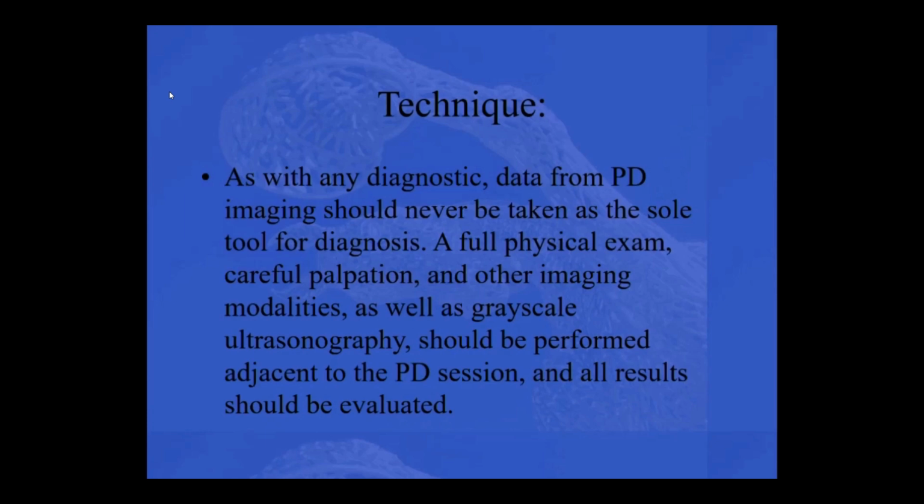What's really important is that power Doppler is just an addition. It's never my own tool or my sole tool. I will always do the standard exam like what everybody talks about. I always have my normal imaging techniques, ultrasound, X-ray, and I just add it on to give me some more information.